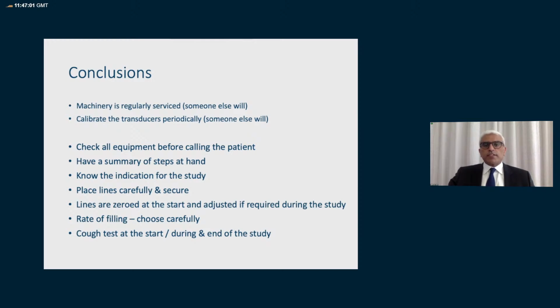Place lines carefully and secure them. The lines should be zeroed at the start and adjusted as required. Rate of filling should be chosen carefully according to the neurological condition. And coughs should be done at the start, during, and at the end of the study.